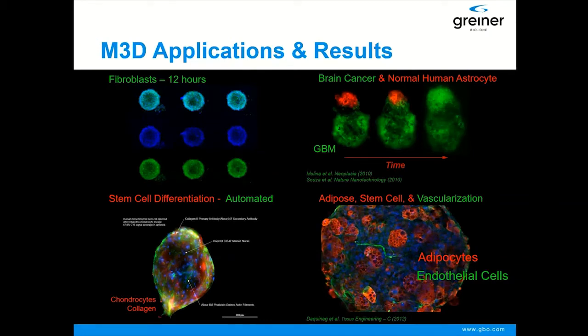This was a co-culture of pre-adipocyte stem cells and endothelial cells, where we were trying to replicate the endothelial cell phenotype within the culture. When we first started, we used a 50-50 ratio of cells, 50% pre-adipocyte stem cells and 50% endothelial cells, mixed them together and observed to see if we got sprouting of the cells within the culture, and we didn't see any.